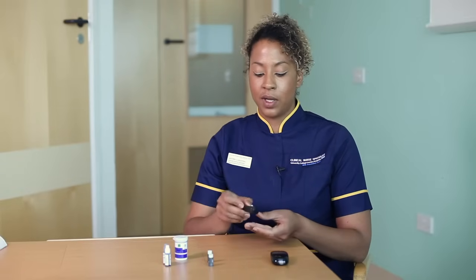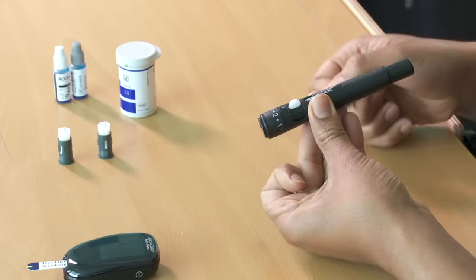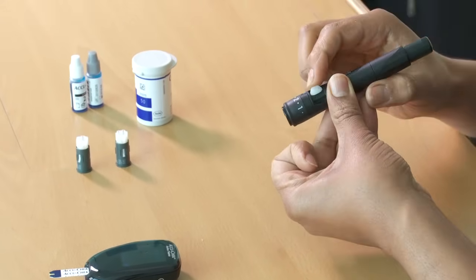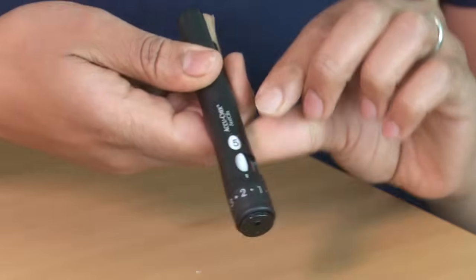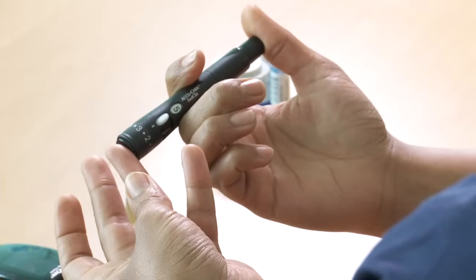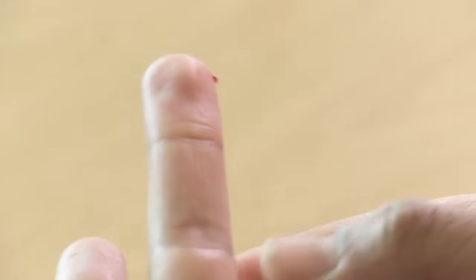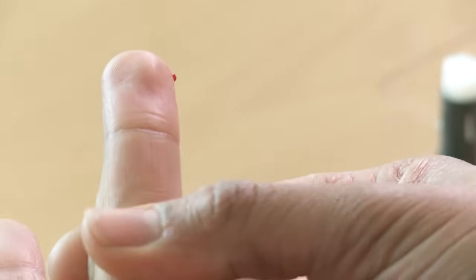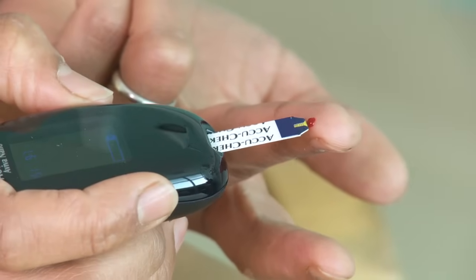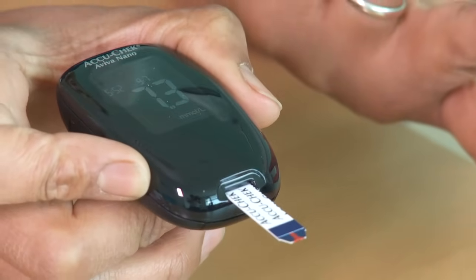Get ready to prick the finger. Picking up the pricker, make sure that you've got it at the required depth, and advancing the lancet onto the next one — you can see that we've got five remaining. Place the hole on the part of the finger that you want to prick and just press the top. Then milk the finger from the bottom to the top, being sure not to squeeze too aggressively. When you've got a big enough drop of blood at the end of the finger, just pick up your meter and place that drop of blood at the end of the strip. You'll see that the blood just automatically drew into the strip, and there you've got your result.